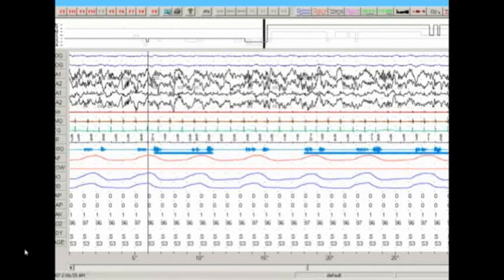This is a technique called quantitative EEG analysis. It is typically used in research protocols when we look at epilepsy patients. However, there's very little work being done applying it in this way to people during sleep. But using the quantitative EEG modules, one can develop a very quantitative and computer-generated analysis of this EEG alpha intrusion phenomenon that is quite easy to score, and it's very reproducible. If we go to the next slide, we can see how impressive the results look.